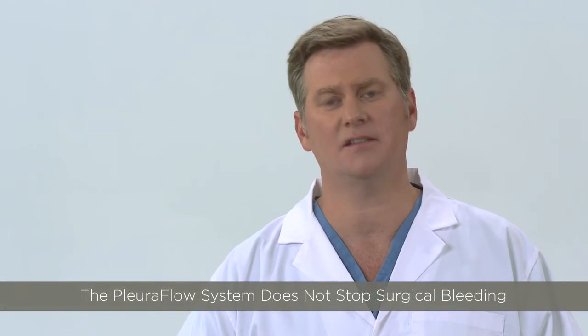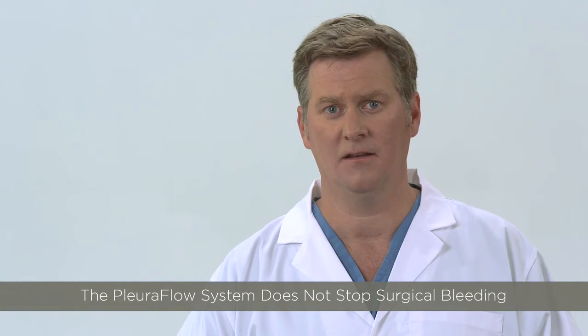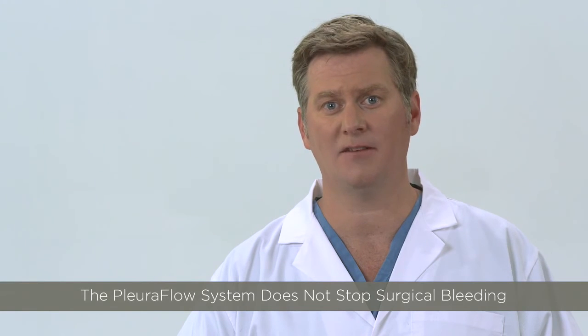This device will not stop surgical sources of bleeding, which may still require a take back to the operating room to control, a decision that is at the discretion of the surgical team.